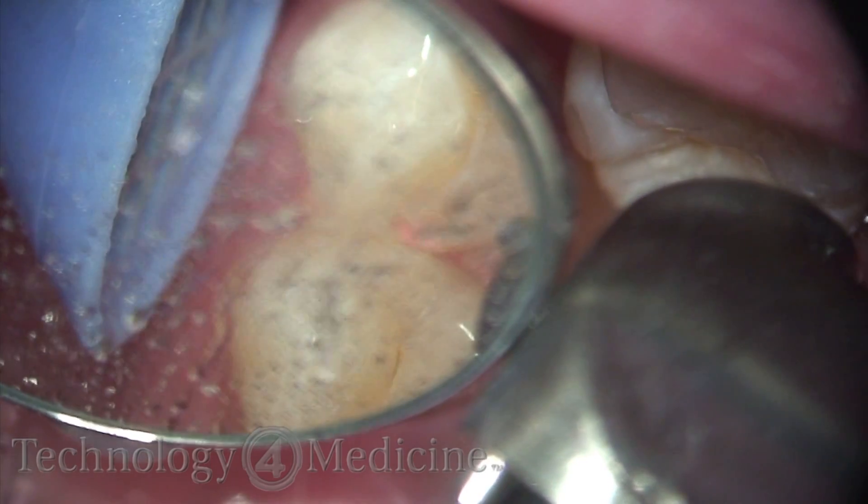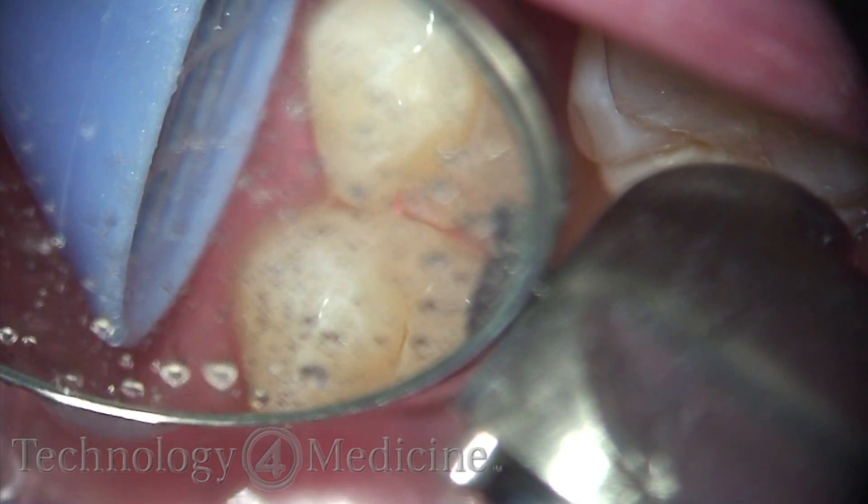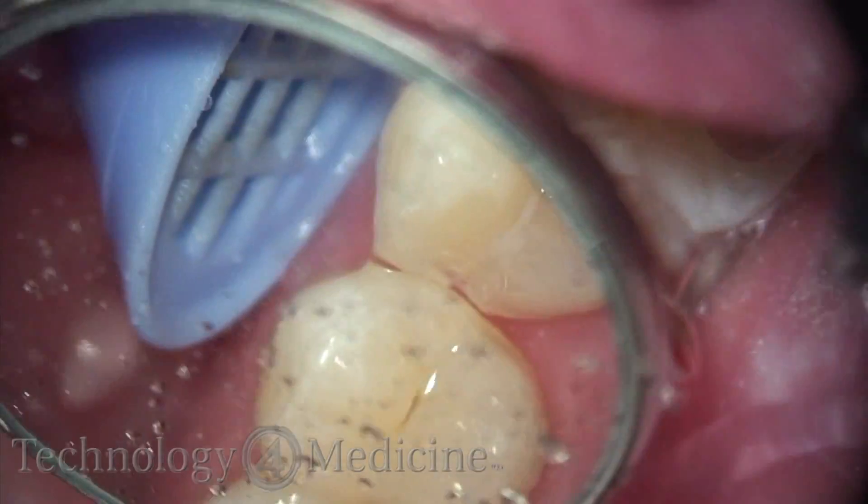It's very easy after training to learn how to control the laser beam and its direction.